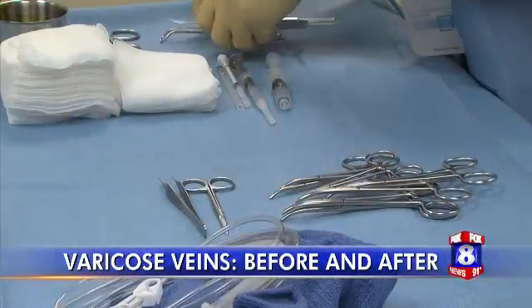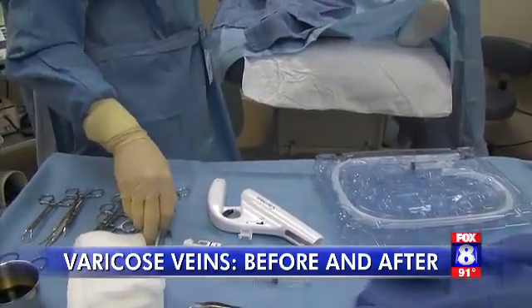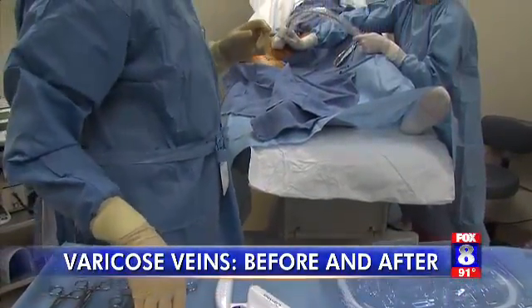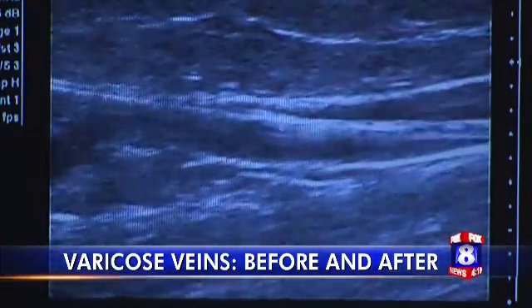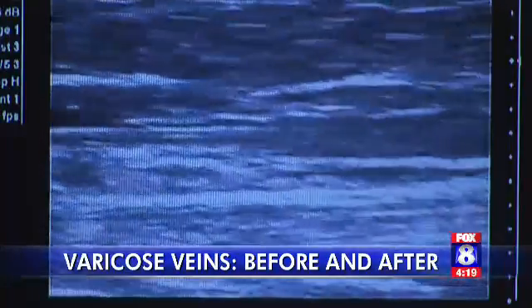Sign me up. Once I've been prepped and my leg sterilized, Dr. Greenberg explains his game plan. In Emily's case, even though the main pressure source is coming from the upper part of her thigh down, she has a couple of large varicose veins here in the calf. The source of the problem is a vein in my thigh, not just my calf.